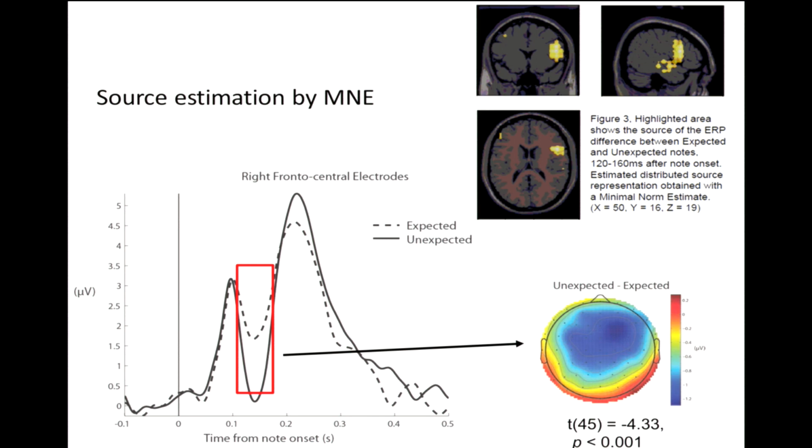So that tells you that, okay, these regions in the brain, these activities somehow are associated with causing the differences between these two conditions. And now that gives you the license to some extent to talk about, okay, now in the literature what these brain regions are being associated with, and then you can talk much more confidently to explain what could possibly explain the involvement of these regions to explain these differences that you see on the ERP.